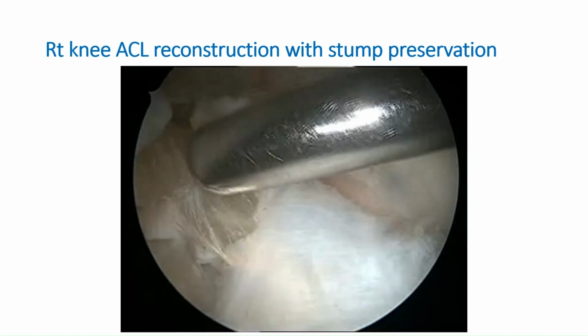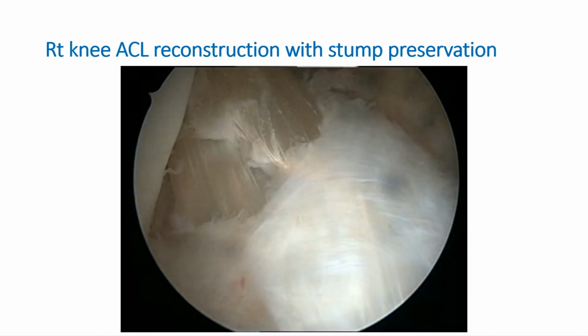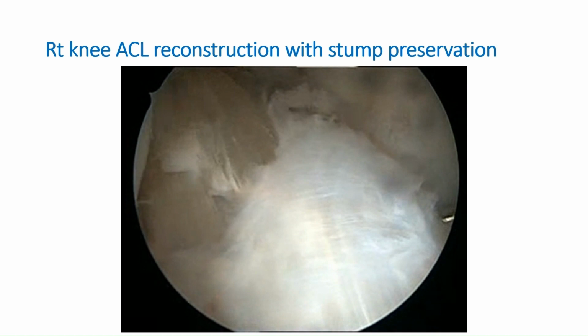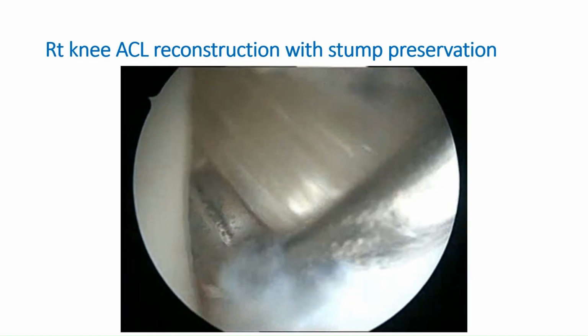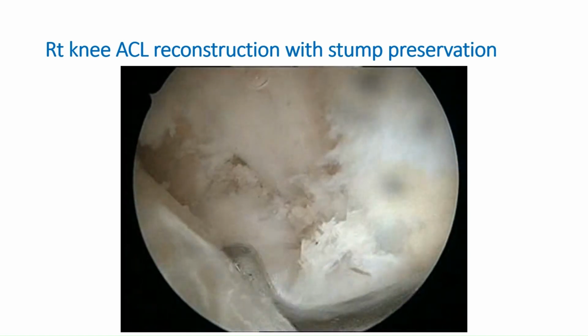We are benefiting from the proprioceptors on the surface of the native ACL. We have an excellent collagen fill, which can never be made only by the rounded 9mm or 8mm. This is an 8mm graft actually. You can never have this whole collagen fill with this graft size.